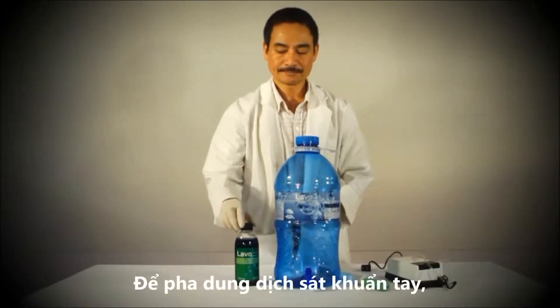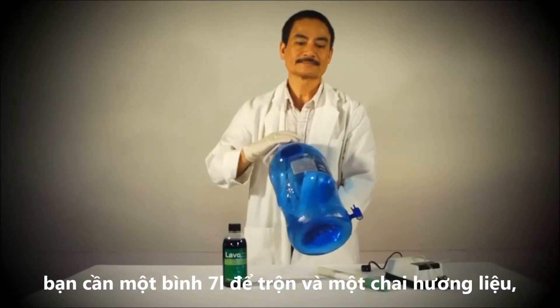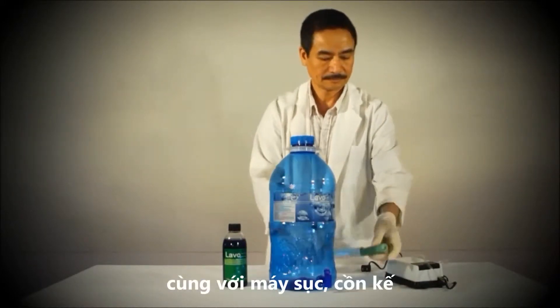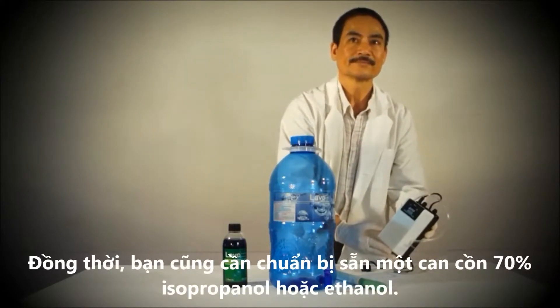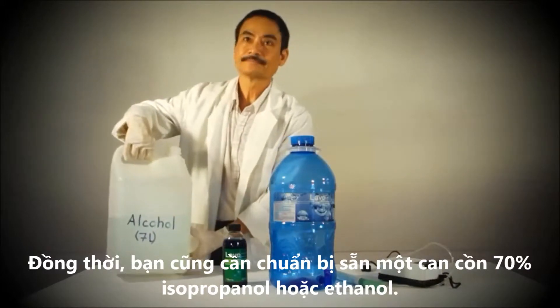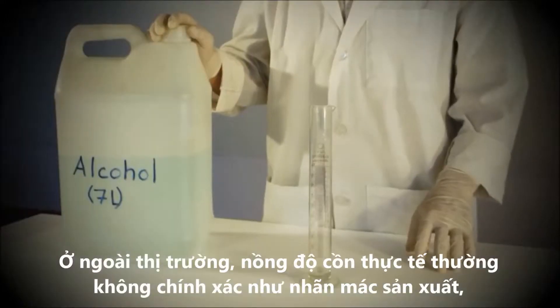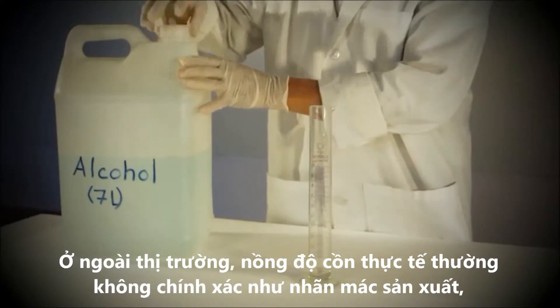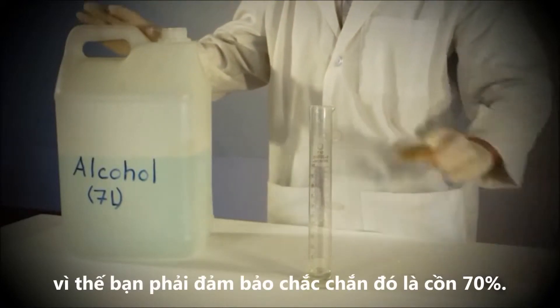To make the hand sanitizer you need one bottle of concentrate and the 7 litre mixing container, as well as the blender and the alcohol meter that are provided in the kit. You will also need to source your own 70% isopropanol or ethanol. It is common that the percentage of alcohol is incorrectly labeled by suppliers, so you must ensure that you have 70% alcohol.